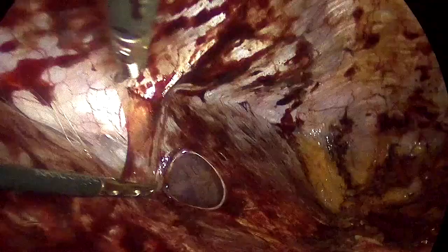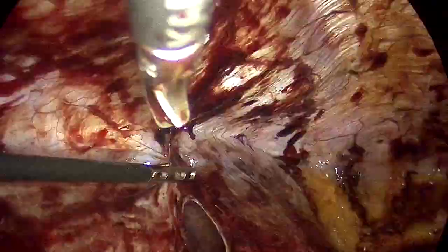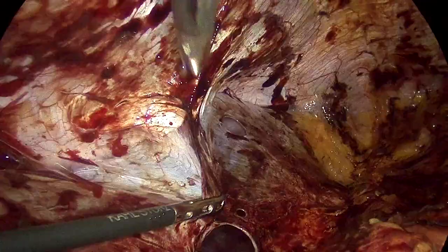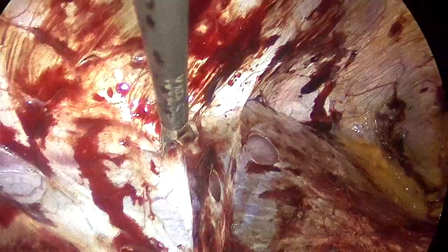The looser I do the dissection, the easier it will be to close these rents in the end — which, by the way, I close in every case. I just don't show it because I don't think it's appealing to watch many simple stitches being placed. This is the final dissection.